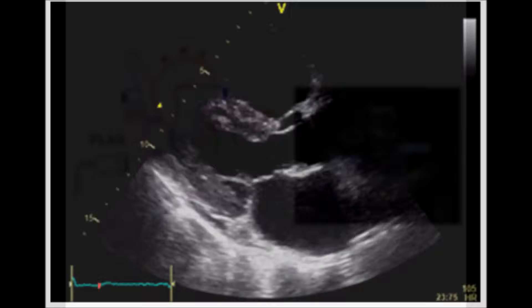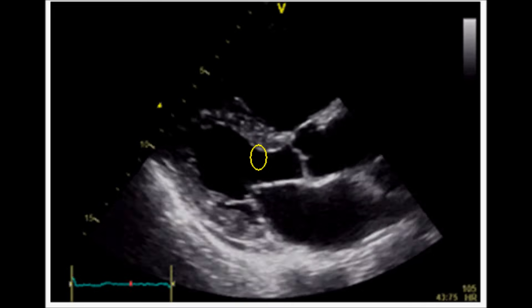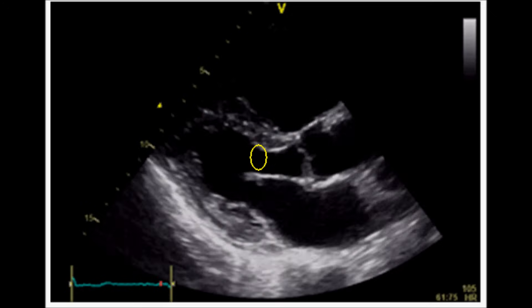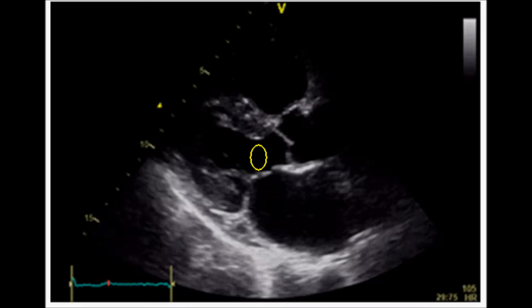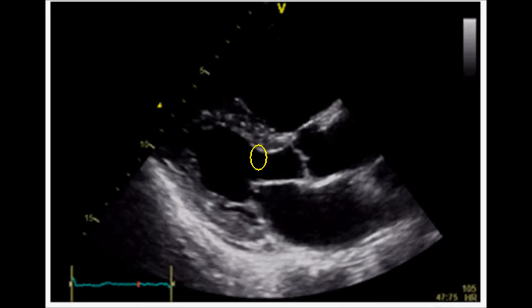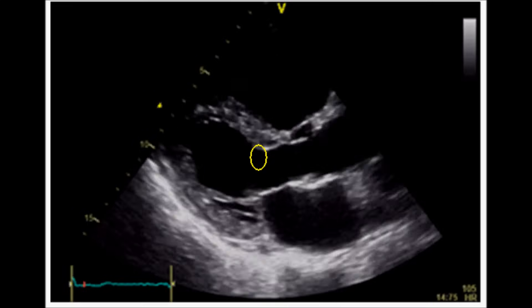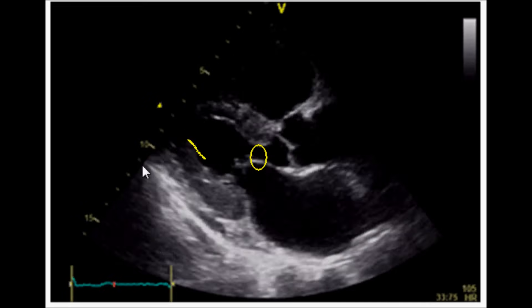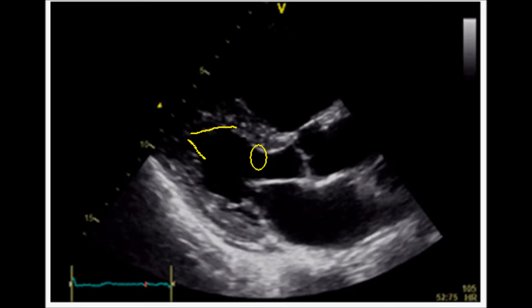To estimate ejection fraction in this view, we look at a few characteristics. First is the movement of the mitral valve leaflets — specifically the anterior leaflet, whose tip is called the e-point. With a normal ejection fraction, the leaflets should have quite a bit of movement, and the anterior leaflet should come in close contact with the interventricular septum. The distance between the e-point and the septum is called the EPSS, or e-point septal separation. Second is the thickening of the myocardium itself, which should thicken to a normal degree.